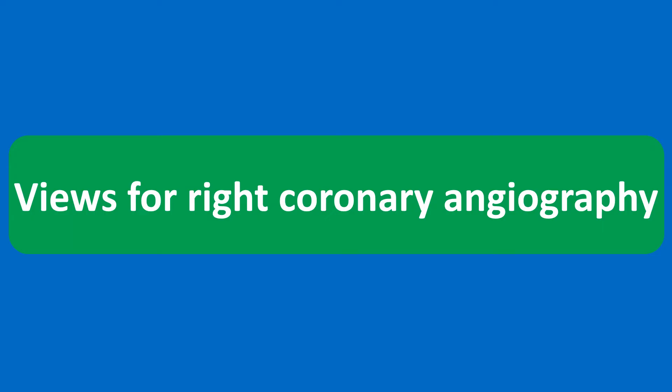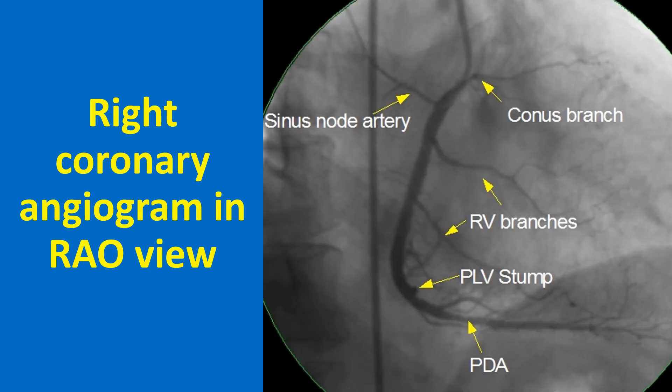Moving on to views for the right coronary artery: the RAO view shows the conus branch and sinus node artery in opposite directions. Right ventricular branches and the posterior descending artery (PDA) are seen well, with multiple septal branches arising from the PDA. The PDA has a mild lesion in its proximal portion. In the illustrated angiogram, the posterior left ventricular branch (PLV) is occluded and only a stump is seen. The atrioventricular nodal artery usually originates near the bifurcation of the right coronary artery into PDA and PLV.